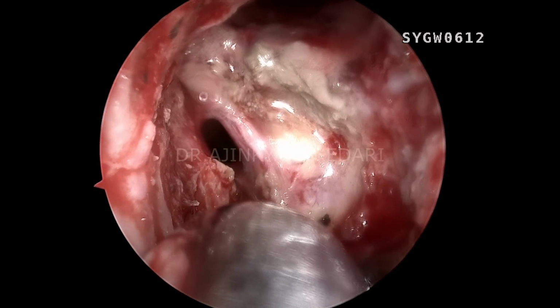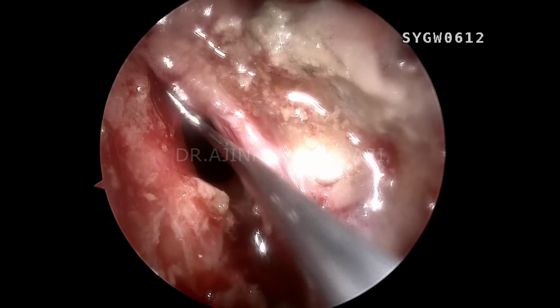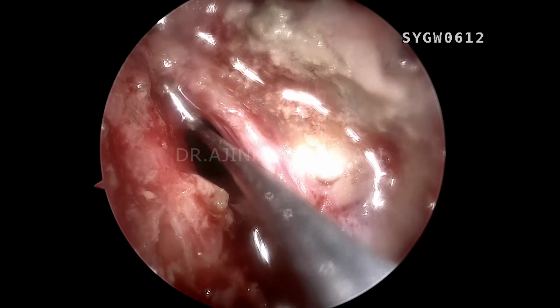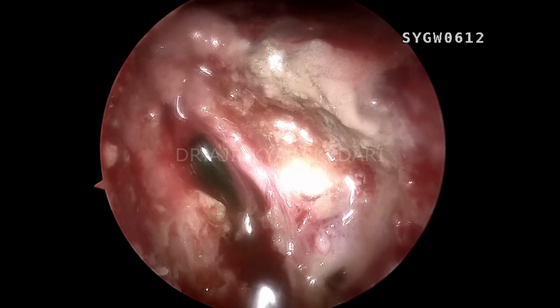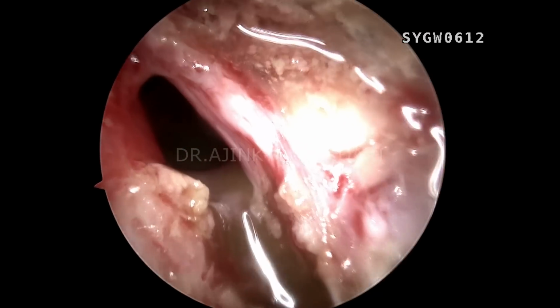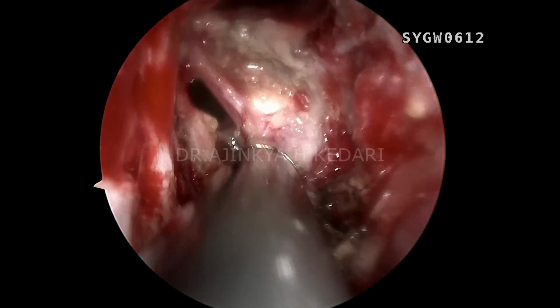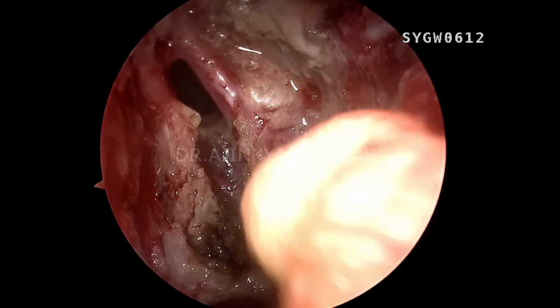Imagine if you didn't drill on that bone and you would just have plugged fat inside, which a lot of skull-base or ENT surgeons will claim to do that way. Well, I beg to differ. I would definitely not follow that technique. I don't want the patient again on my operation table with a failure. So I will definitely drill on the bone and make a huge opening and uncover the actual defect from below. After having drilled this bone, you can see that defect is really huge, and now I have it head on with my 0 degree.